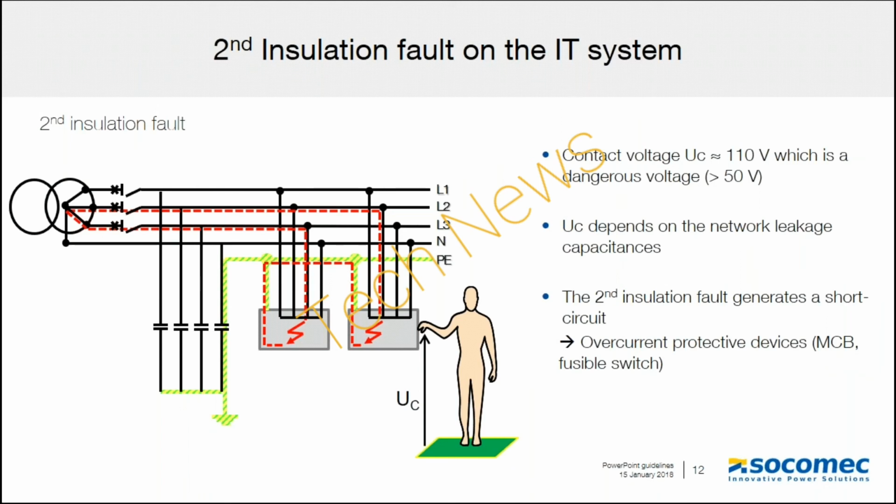The use of an insulation monitoring device, or IMD for short, is mandatory to locate the occurrence of the first insulation fault. The IMD is also required to initiate an audible and visual alarm.